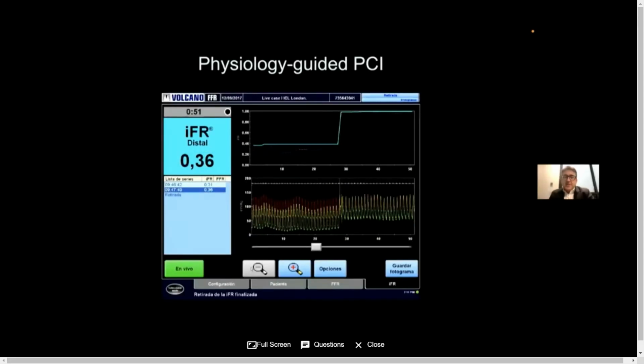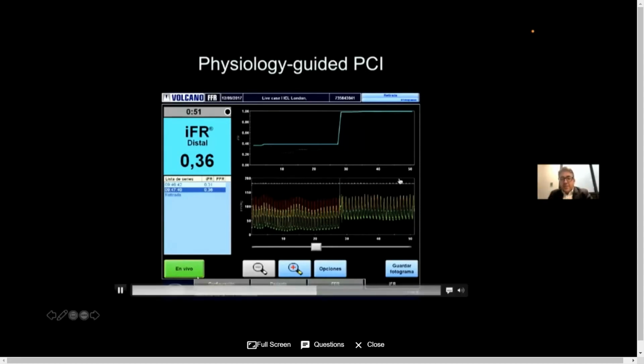The next thing you have to do is fuse this together with the angiogram. It takes a few seconds to do. You pull up the angiogram, and we just make sure that the map has been produced correctly so that the computer knows where the center line and the data essentially lies. Once that's been done, over the top of it, you're fusing together the angiogram.